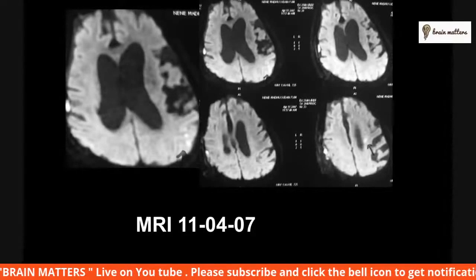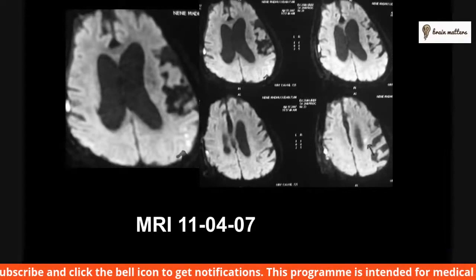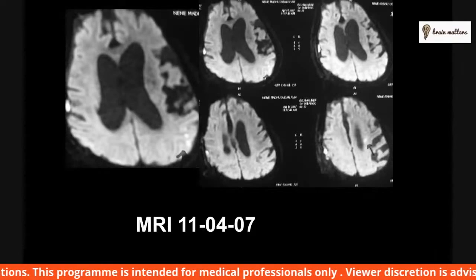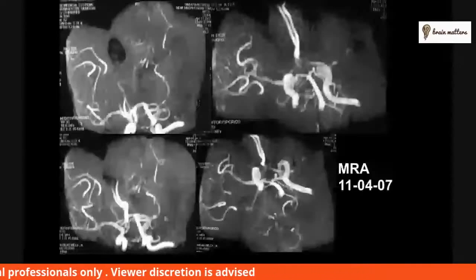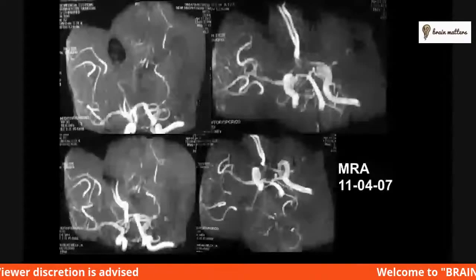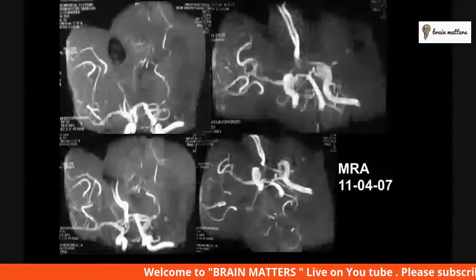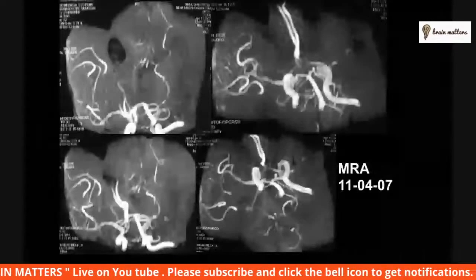You can see it in the bottom right frame where it is marked out by the arrow. So that was a single lesion and probably accounted for his episodes of confusion, dysarthria and aphasia. And this was his MRA at that time, on the 11th of April in 2007, which showed that there was no MCA on the left side.